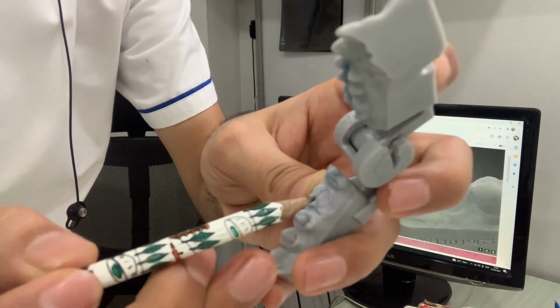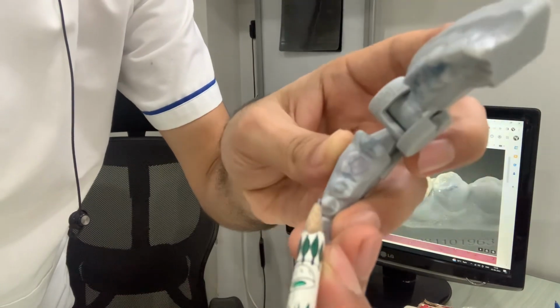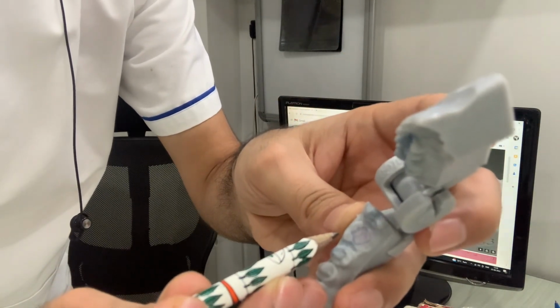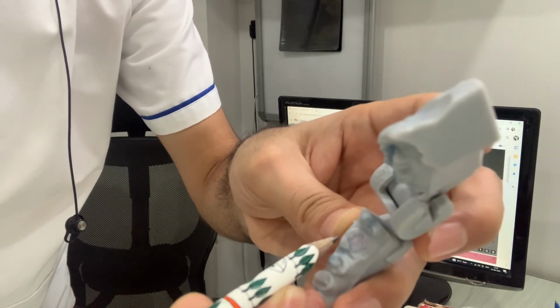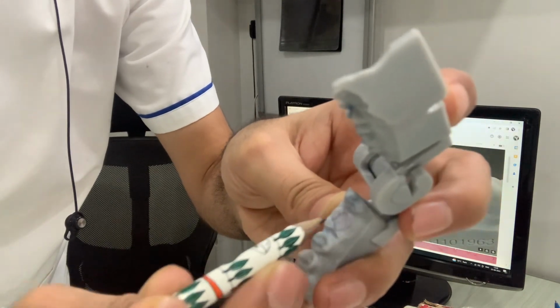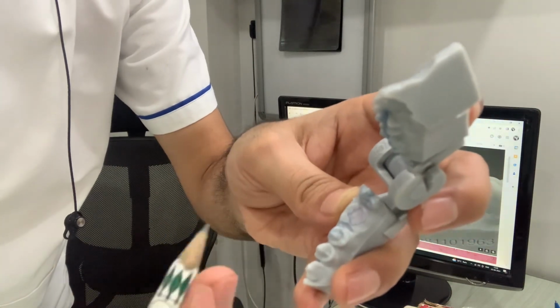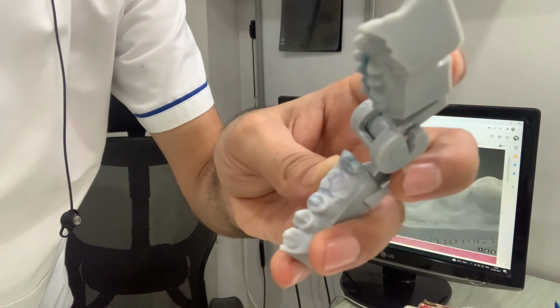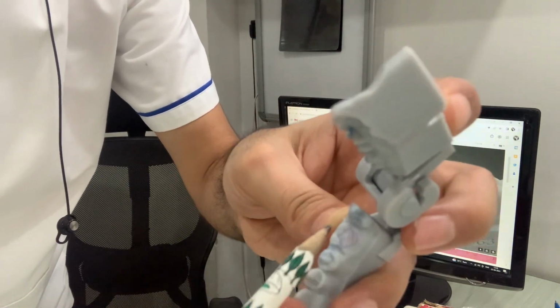So imagine this is the amount of tooth decay, and we perform a root canal treatment. I have placed a composite restoration inside the chamber. Now imagine I am going to do a tooth preparation for a full coverage restoration or a full crown. If I reduce around 1.5 millimeters of this buccal tooth structure, the lingual tooth structure, and the proximal areas, what will be left? What will be the residual dentine thickness or residual tooth structure after the tooth preparation? Nothing, right? So in such cases, what is the best idea?